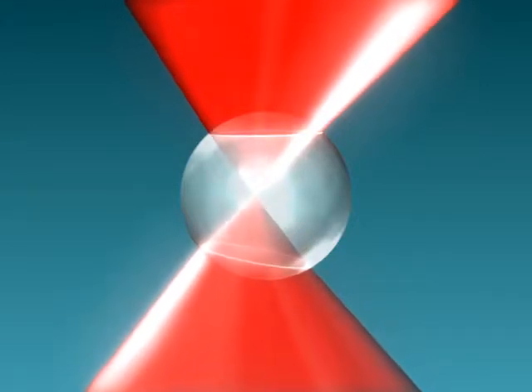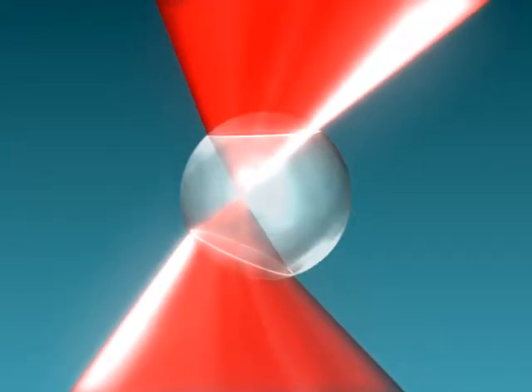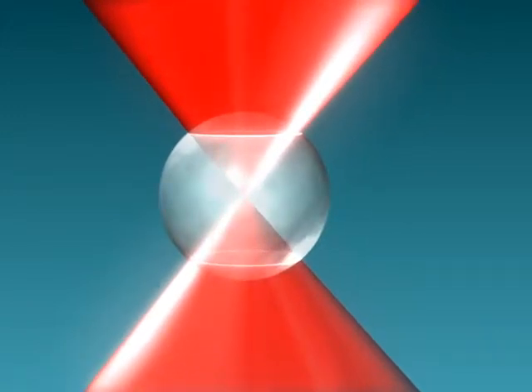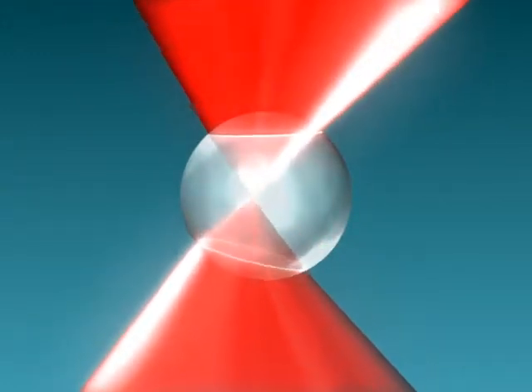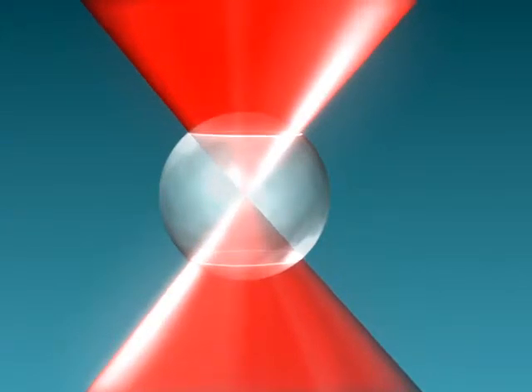If the beam is shifted to the left, the microsphere lenses the light to the right. Since light carries momentum and the microsphere pulls the light to the right, the microsphere is pulled to the left with an equal force. The microsphere is pulled to the left until it is re-centered on the light. As the laser is moved from side to side, the microsphere follows the focused laser point.